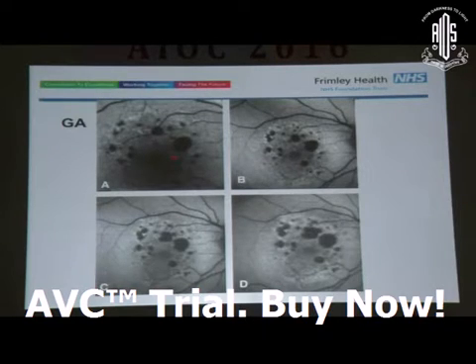Now, this is again a patient who's been followed up who had multifocal geographic atrophy, and you can see that the lesions are increasing as years go by. And this sort of thing is really important now that we have treatment for geographic atrophy. Previously, geographic atrophy was not of interest to us because we did not have any treatments. Now we have quite a few trials going on.